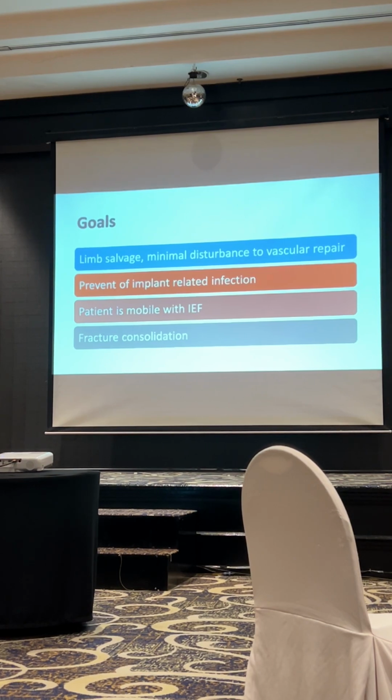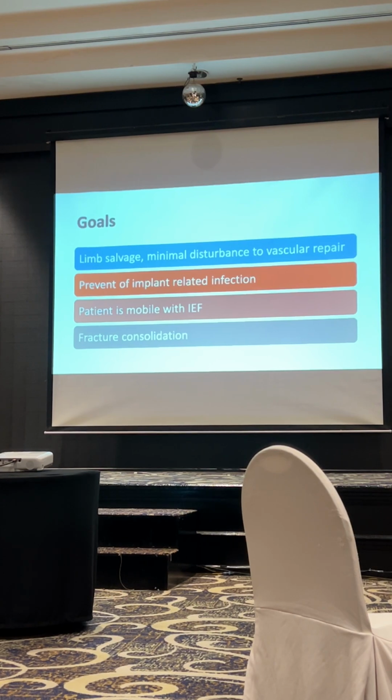So they want to fix an Elizarov to get minimal disturbance to the vascular repair. They want to prevent implant-related infection, because even if they put an internal implant, it gets infected. So the patient is always mobile on Elizarov, and finally the goal is to get fracture consolidation.